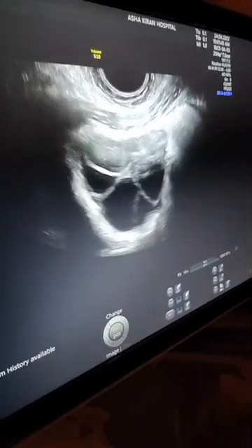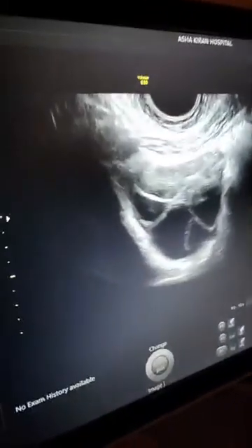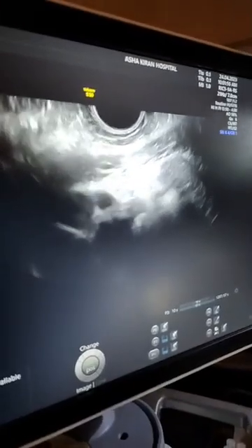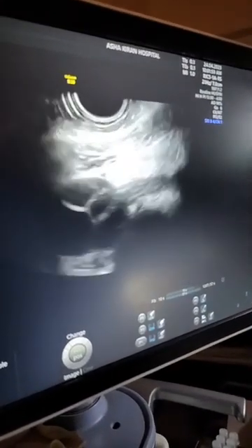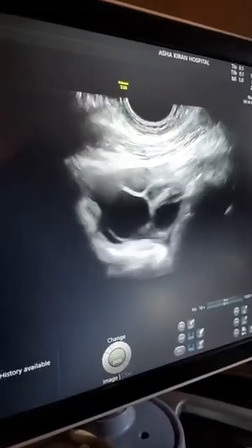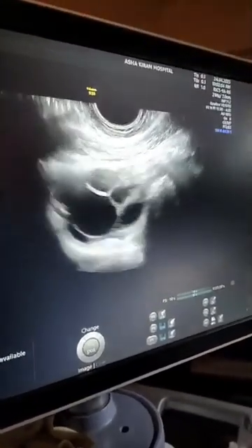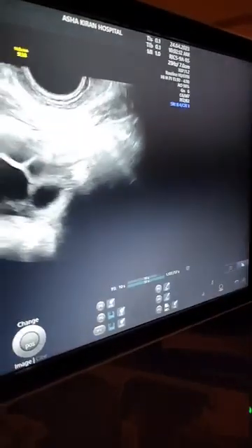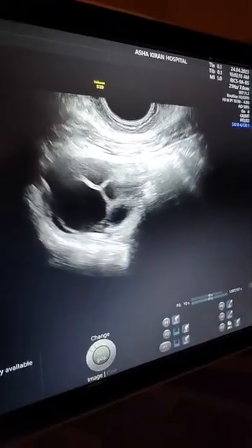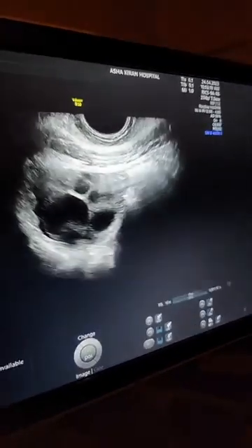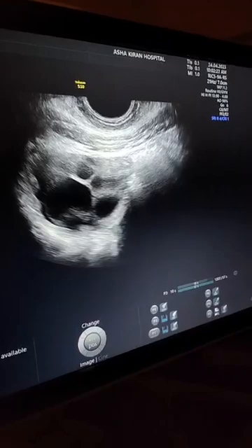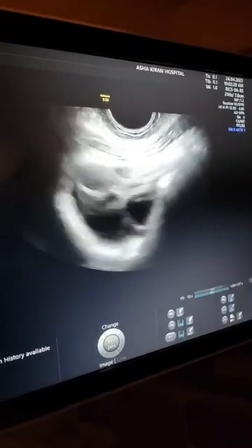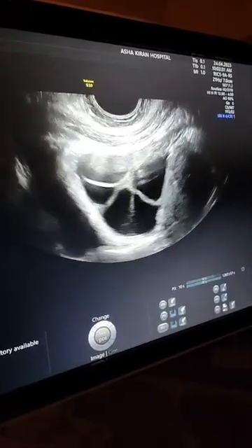Can I have the light? Can I have the needle? Switch off the light please. The only difficulty in this procedure is to access the ovary. Now I will fix this — can I have the light there.